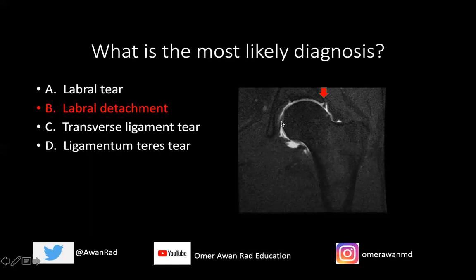The ligament of teres is this structure right here — it goes into the fovea capitis and is a dark linear structure connecting with the transverse ligament. The transverse ligament bridges the anterior and posterior rim of the acetabulum, and that is also not torn here. So this is a nice example of what a labral detachment looks like on an MRI arthrogram.